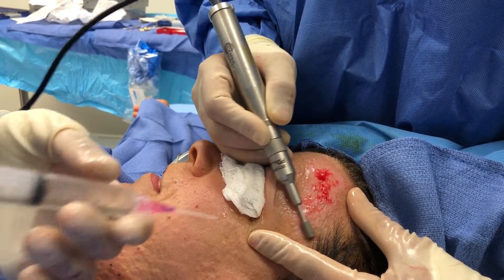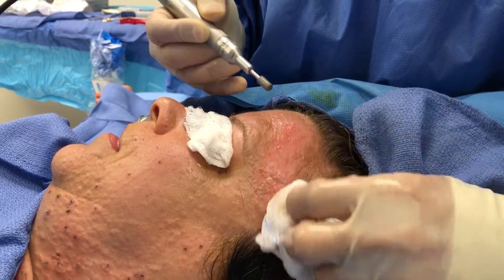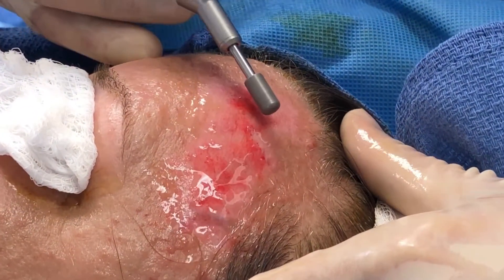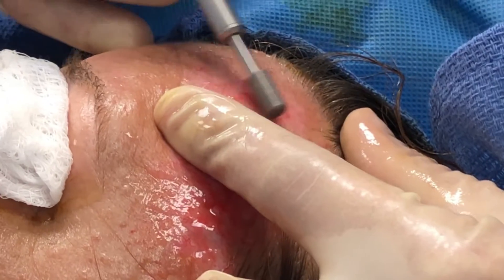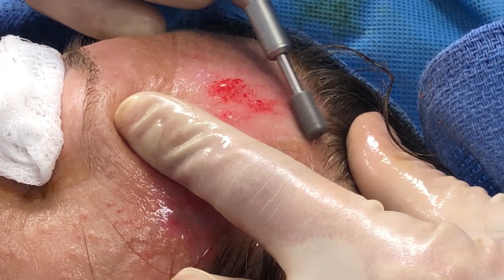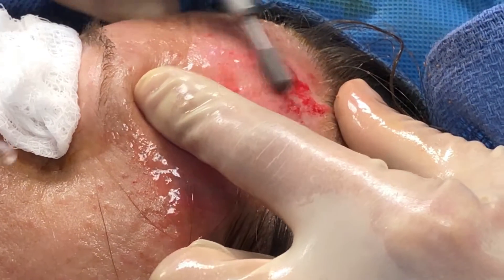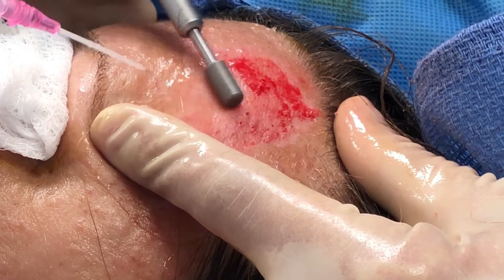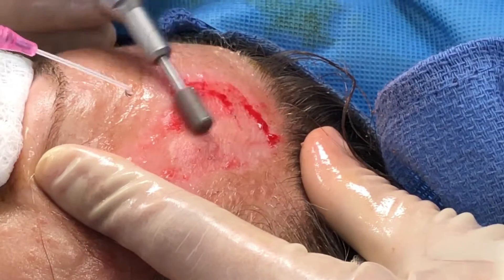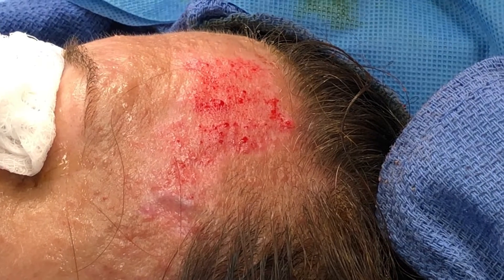You can see the epidermis sort of sloughing off as I go through it. We take a quick look and see where our texture problem still lies. You can see some of the shadowing right up through here, and we're going to make sure that it's taut. We're essentially sanding off the outer layer of skin. It's already looking better, and we're going to do that for the rest of the face. We'll check back later.